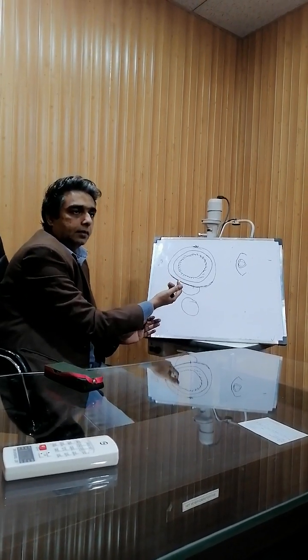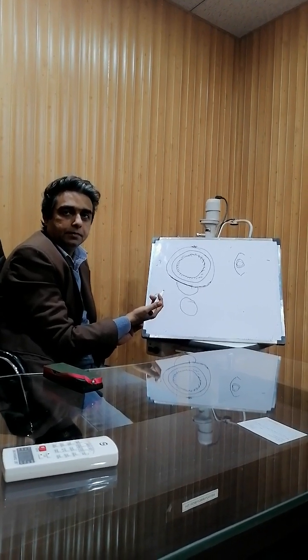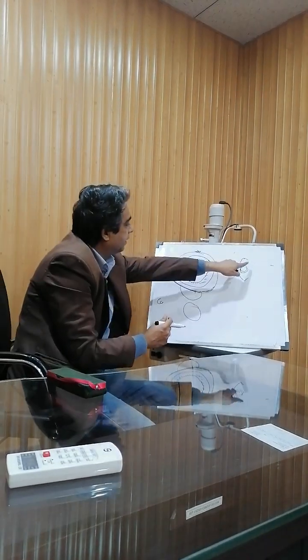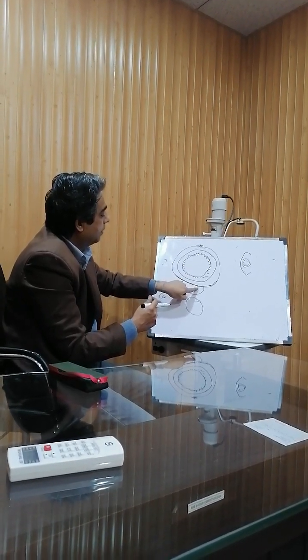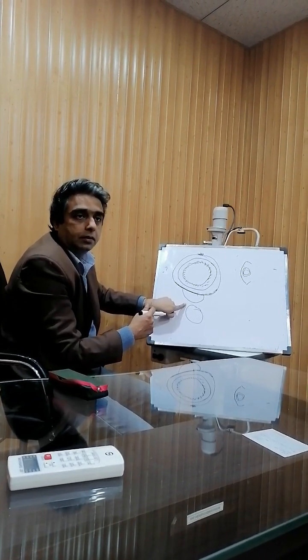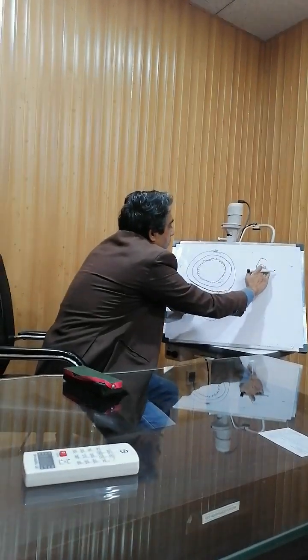It will come out of this wound. Understood? When we have cut it and removed the anterior capsule, we give the pressure, and it will come out through the lips of the cornea and sclera outwards. Understood?